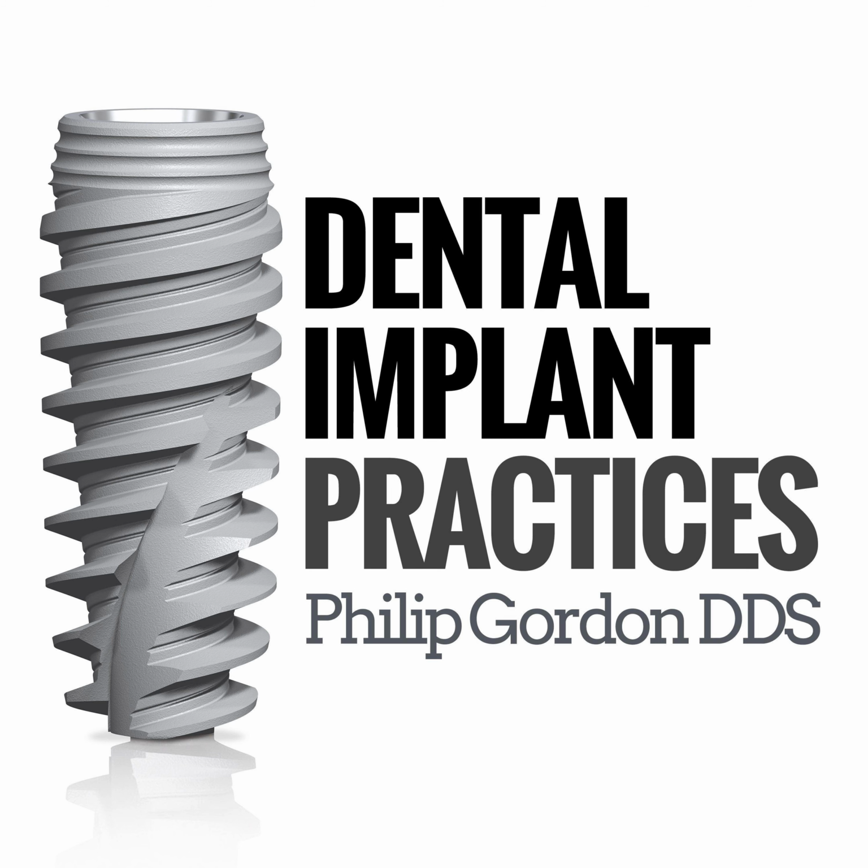So the implants go in very accurately, and then we do bone grafting with freeze-dried particulate Symbiose around the implants, put the cover screws on, cover that with a resorbable membrane such as the Symbiose collagen membrane, and then we'll close the wound primarily in order to allow that to heal.